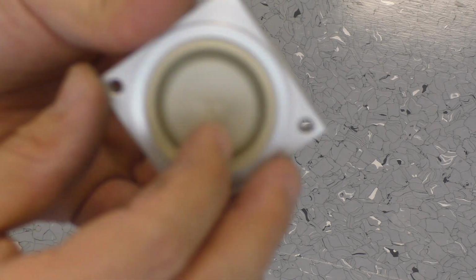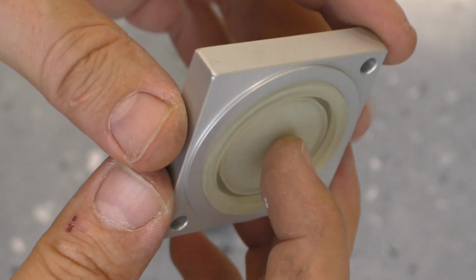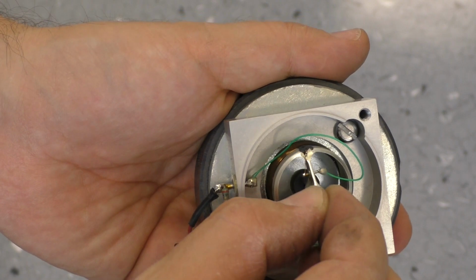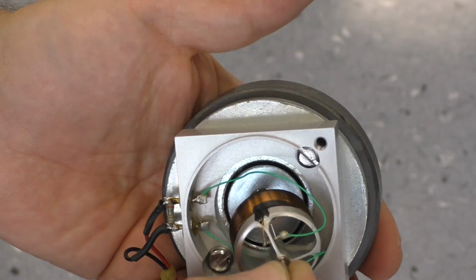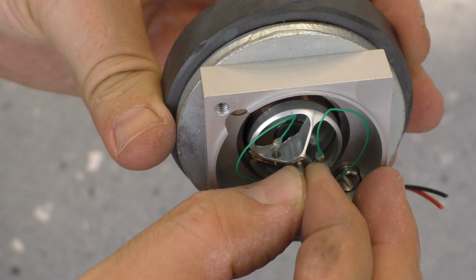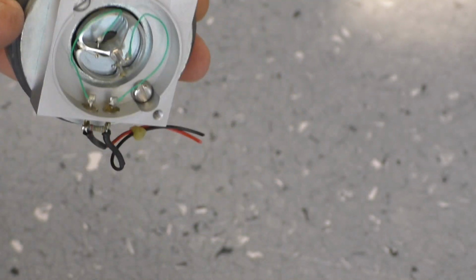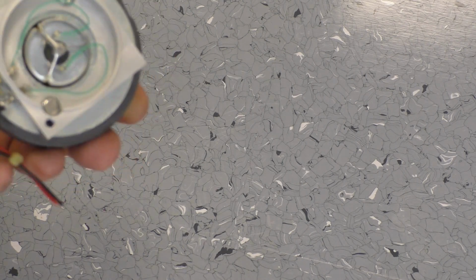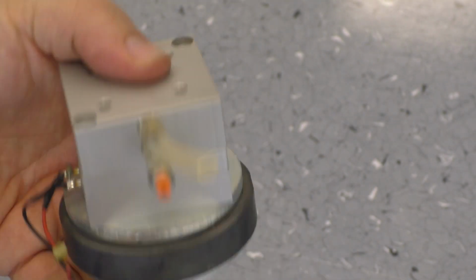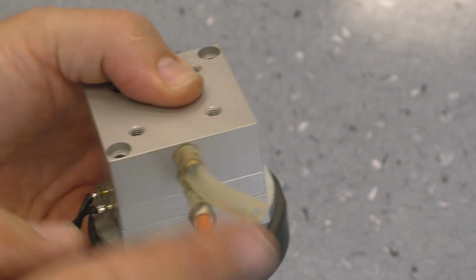Oh, there is a diaphragm, some rubber piston device thing. So I think this is not rotating. It's pushing up and down like that. Yeah, like I said, it looks like a magnet from a loudspeaker, and it works like a loudspeaker. Pushes on that. Where is it? Is it gone? Okay. Oh, here. Pushes on that rubber silicon diaphragm here, and then pumps air or whatever from one hose to the other.